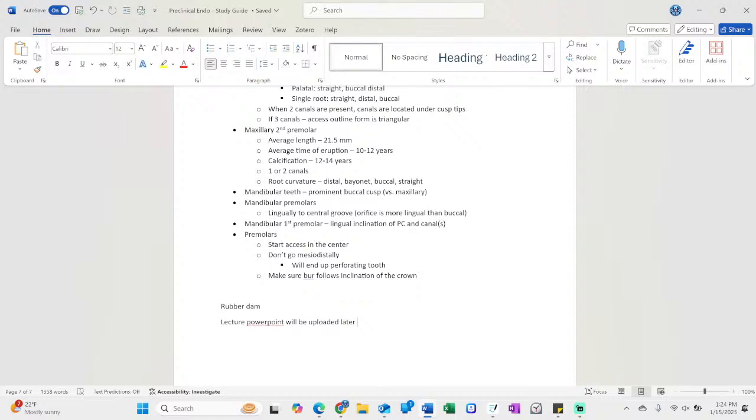Why are we putting it on? He's going to tell you. Patient protection. He's not going to swallow anything. You have hypochlorite. Remember, we never say the word bleach, but actually that's what it is. So you don't want your patient to swallow. The lips are exposed, the cavity is open, and everything can drop there.